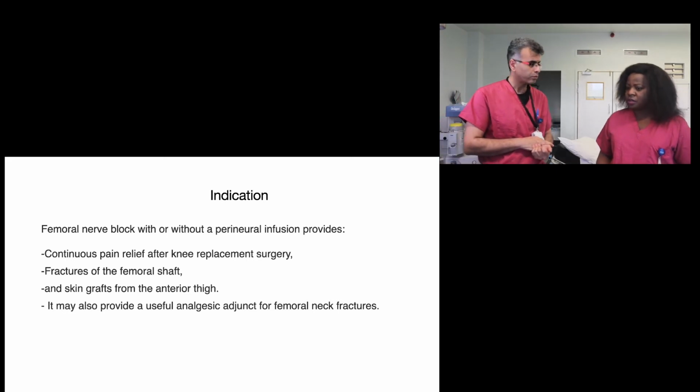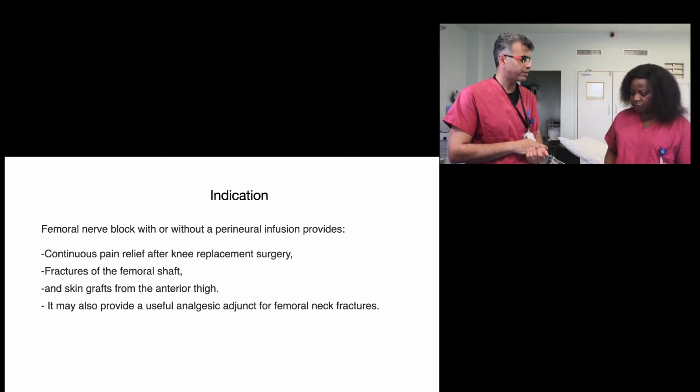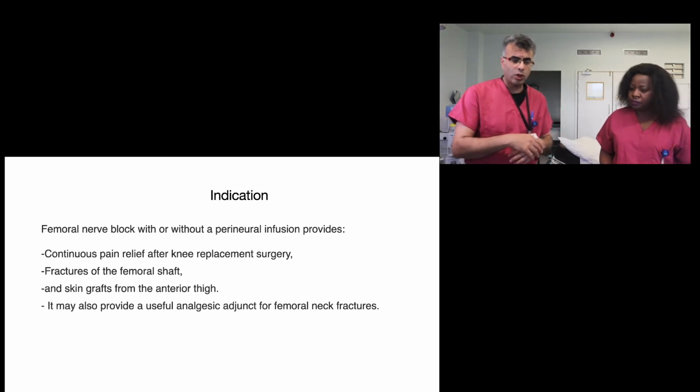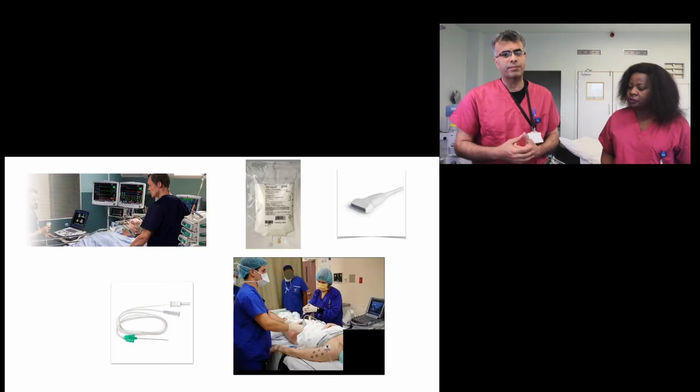Okay, thank you. Because now we know where to use the femoral nerve block. Yes. Now, Dr. Mohamed, do you have any special techniques or tips that you can give us when we're doing the femoral nerve block?